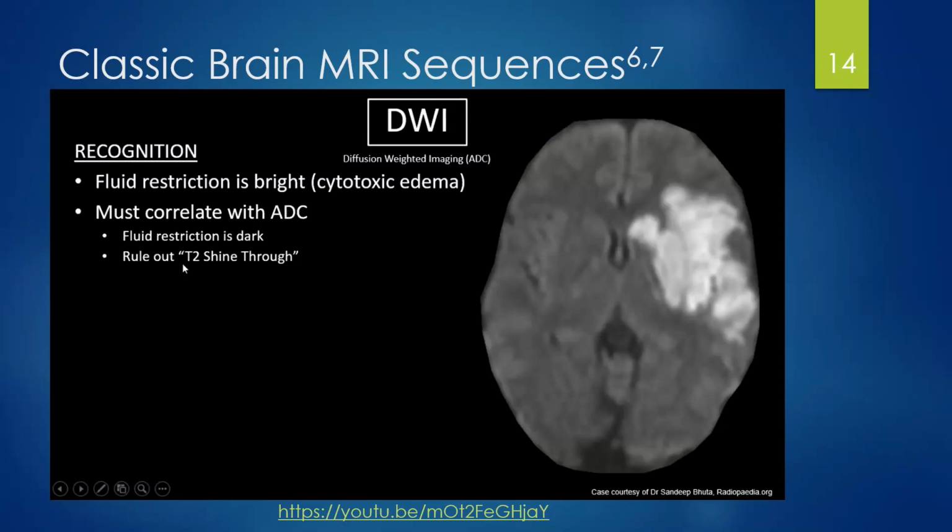And then there's also a T2 image pancaked on top of it to give you some anatomic detail. So what can happen is if you've got an area of very high intensity in T2, it can shine through the pancake stack and trick you into thinking you've got an area of ischemia, when if you went back and looked at just the raw data, you wouldn't see it.